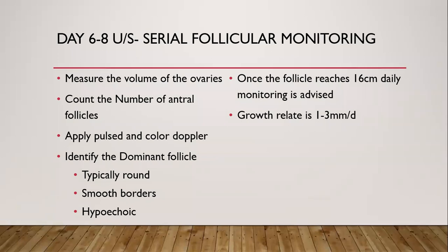At this point, we should be able to identify the dominant follicle. Remember, when you begin the baseline scan, you may see a follicle that is bigger than the others, and you would assume that it could be a dominant follicle. But at this point, you are now able to determine that this is a dominant follicle. Remember, when a dominant follicle grows bigger than the others, the hormones it releases suppress the growth of other follicles.